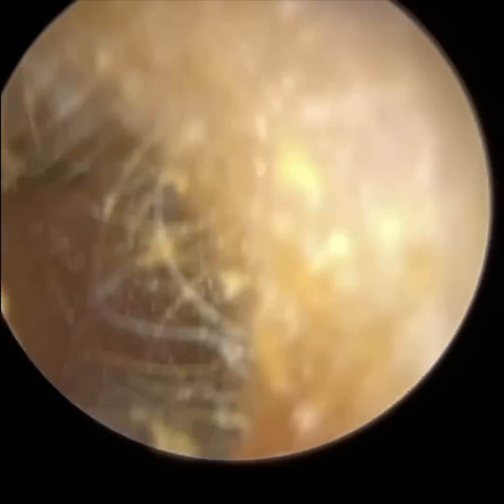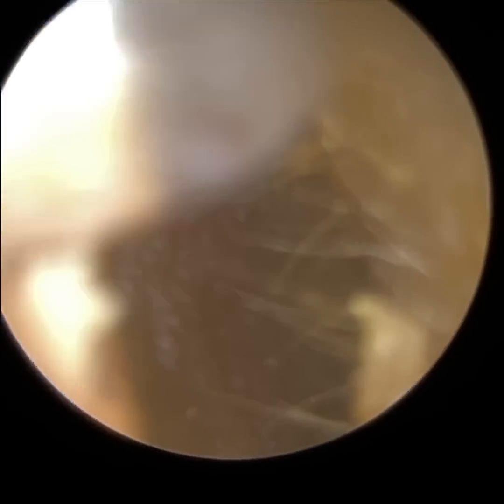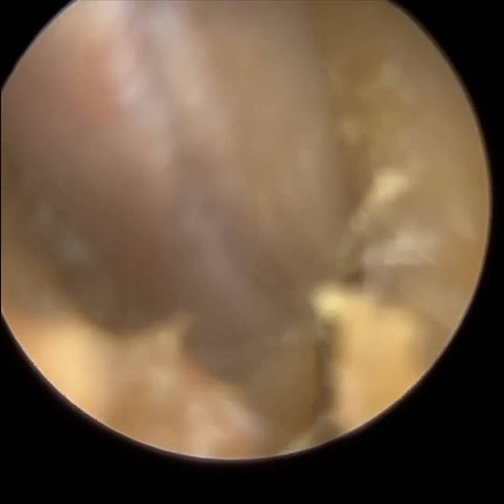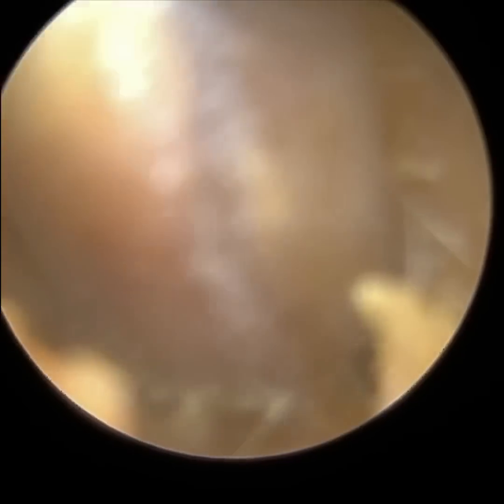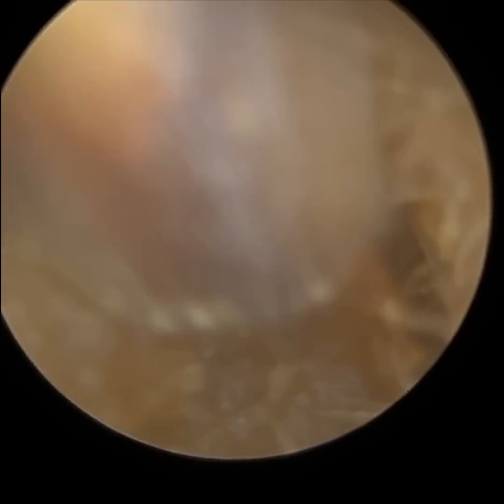We have here a patient who's 10 years of age and they have to attend every 6 months or so to have their right ear cleaned of this occluding, soft, mushy earwax and dead skin keratin. Their left ear is always clear of wax, it's only this right ear.